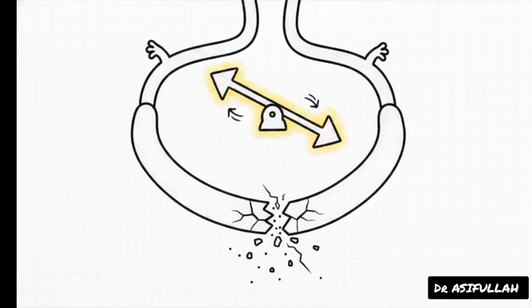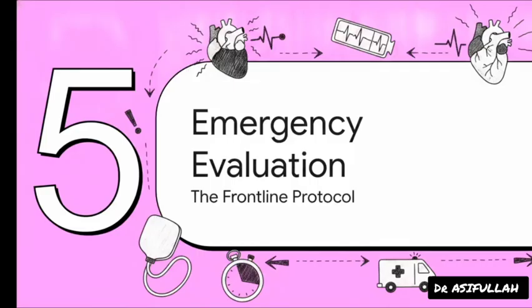Now here is something you absolutely cannot afford to miss. You must recognize that alternating bundle branch blocks on an ECG are a deeply ominous predictor of sudden complete heart block. It unequivocally demonstrates bilateral severe failure of the entire His-Purkinje system. This is a massive leap in danger from a benign, isolated first-degree AV node delay. If you see the block alternating from right to left, the entire highway system is basically on the verge of total collapse.